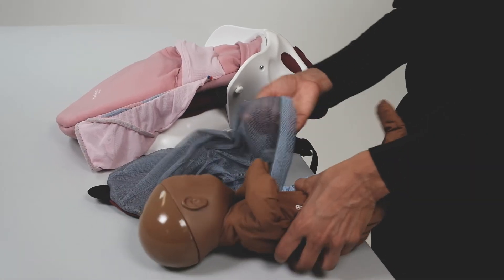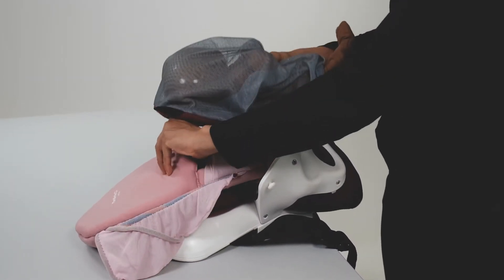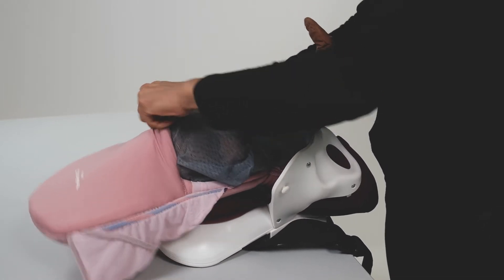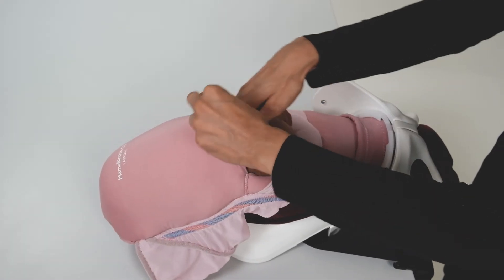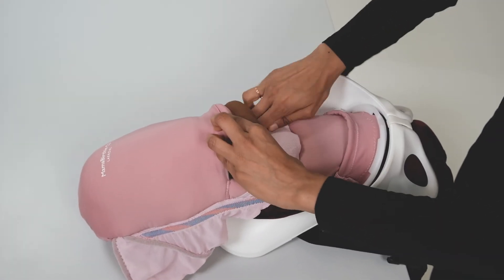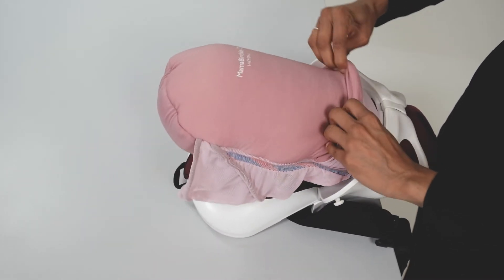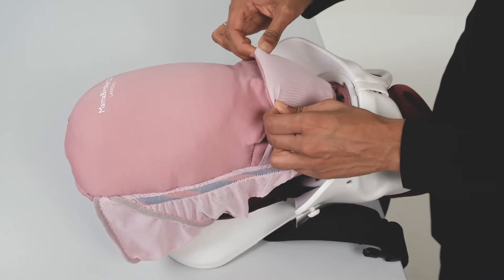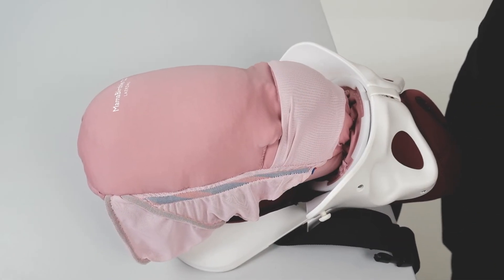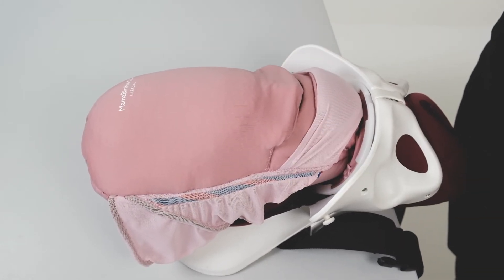To practice a breech birth, place the head at the fundus. Fold the legs into the uterus, or low, beneath the incision.